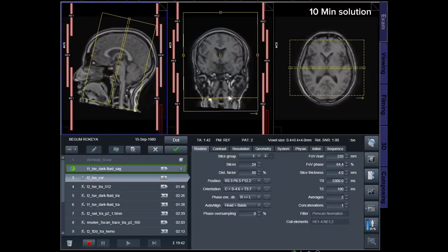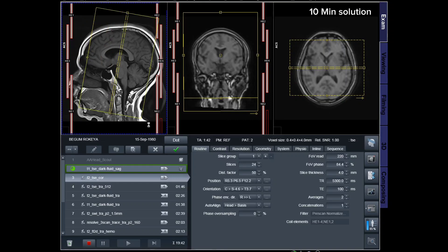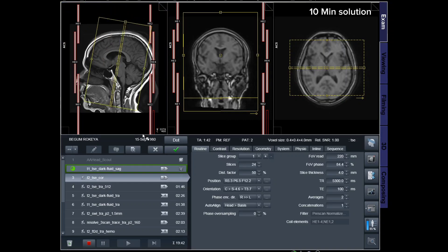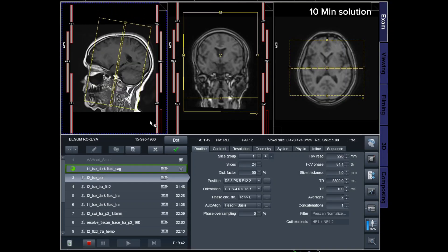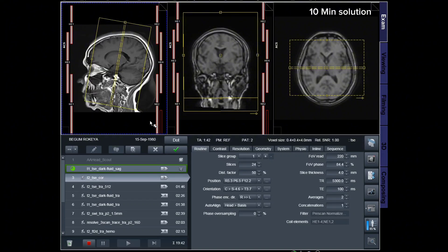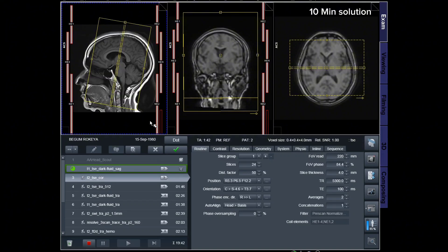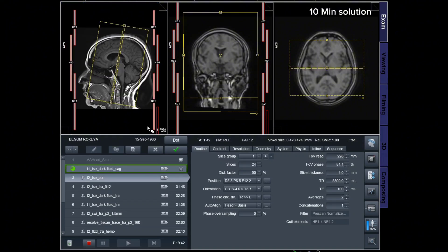Plan the coronal slices on the sagittal plane and angle the planning block perpendicular to the line along the genu and splenium of the corpus callosum. Verify the planning block in the other two planes. Ensure that an appropriate angle is maintained in the axial plane, perpendicular to the midline of the brain.